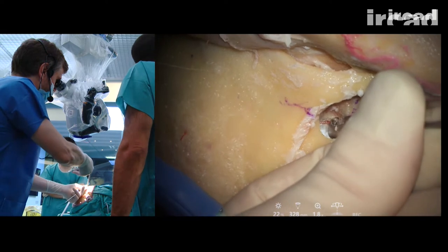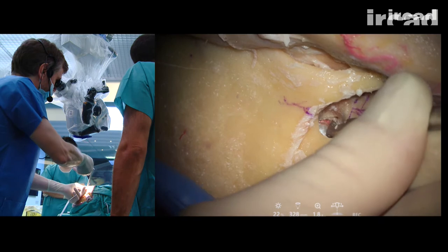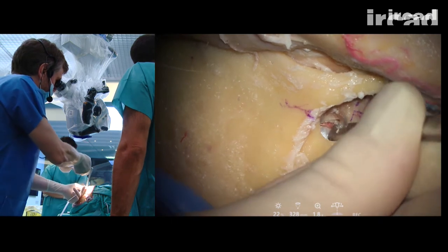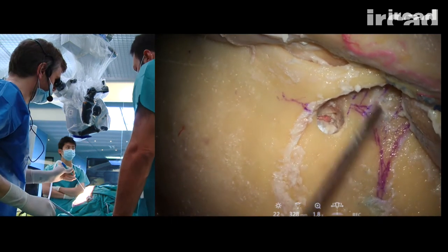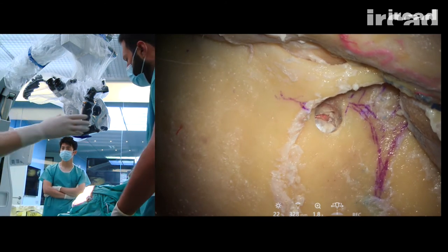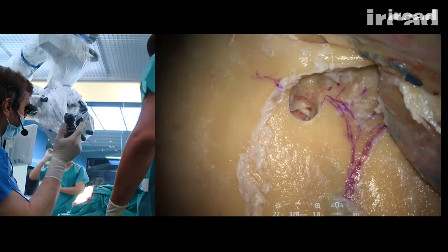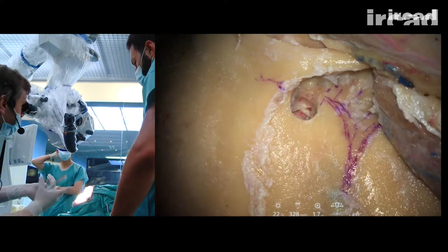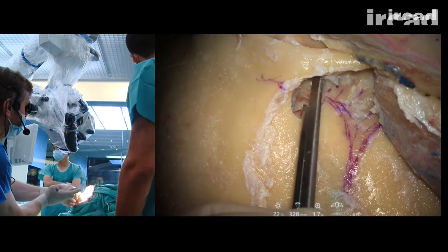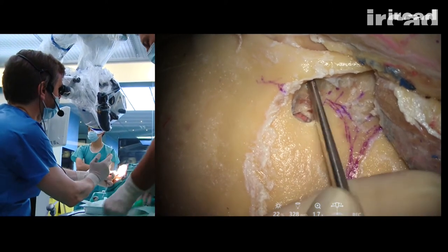Yes, the dura is very thin and is a little bit open here. Okay. So here I really have the McCarty keyhole, with here I am into the orbit.